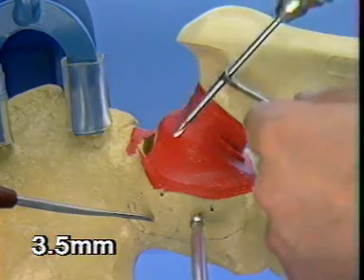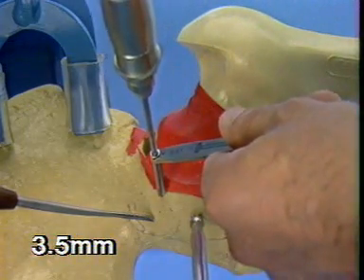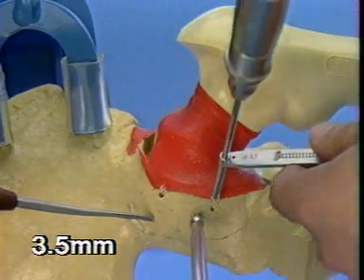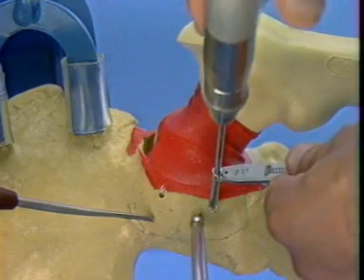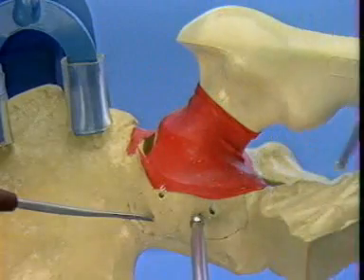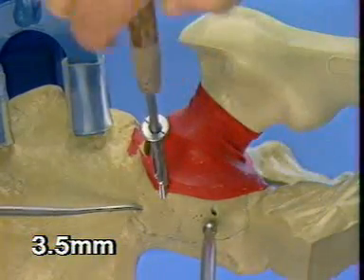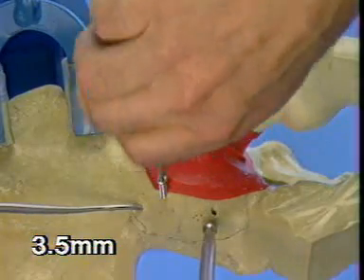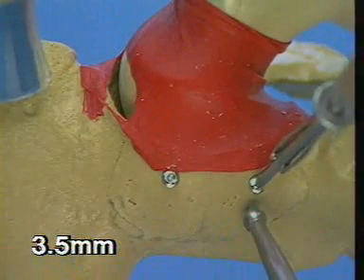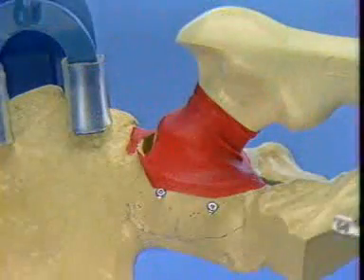Now that we're satisfied with the hole positions, the fragments are over-drilled with the 3.5 mm drill bit for placement of the 3.5 mm lag screws. Insertion of the corresponding length screws. It's sometimes best not to fully tighten the 3.5 mm screws at this point if obliquity of the screw direction to the fracture plane causes a displacement.